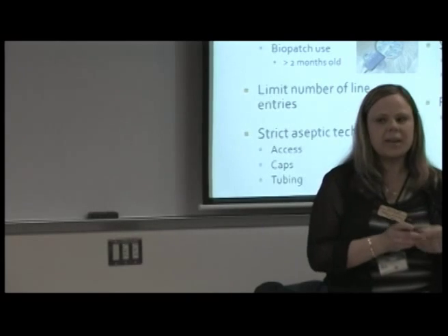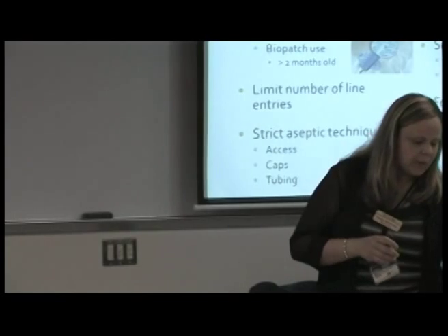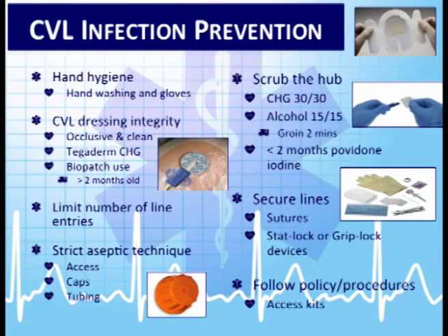They're in the hospitals. They're not all orange. Some of them may be green. Some of them may be orange. It'll be up to your medical directors and your departments on what kind of equipment that you guys are going to have for central line access. Those tabs or caps also go on the IV tubing. So when we have our IV tubing, we have a couple of our med ports along that tubing. They also get put on there because, of course, we might access them at different times, and sometimes in the ambulance they might lay in the bed next to the patient. The patient may touch it, it may hit something, so we want to protect all of those areas.